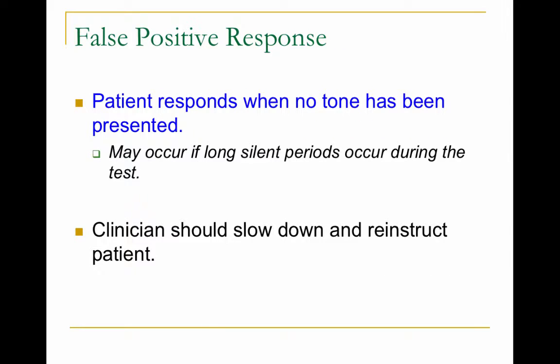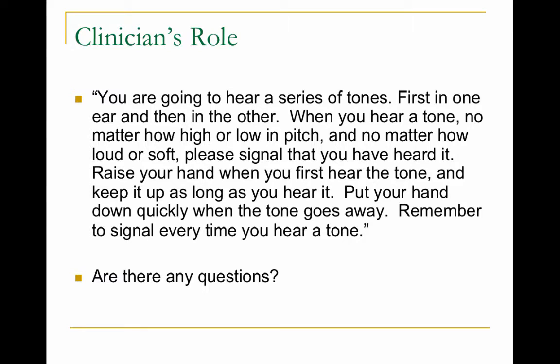A false positive response occurs when a patient raises their hand even though there's no sound. They're positive that there's a sound, but they're false because you didn't put a sound in. This could occur if there are long periods of silence, where the patient starts to get confused: did they hear a sound or not? When you see a lot of false positives or false negatives, the best thing to do is to stop and re-instruct the patient about their role in the testing, what they need to be listening for.